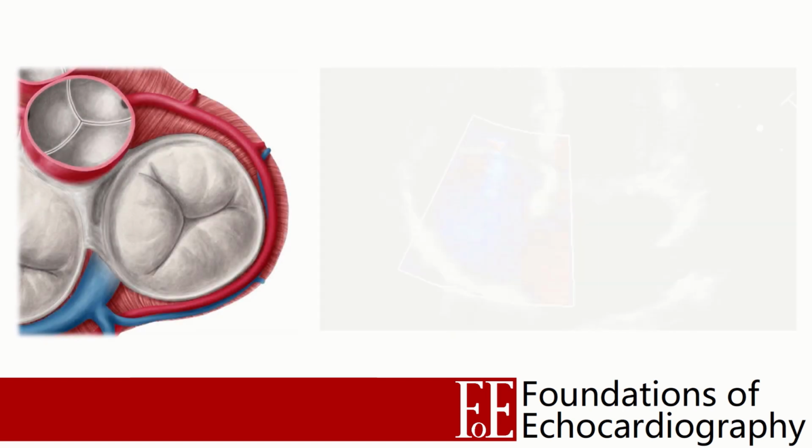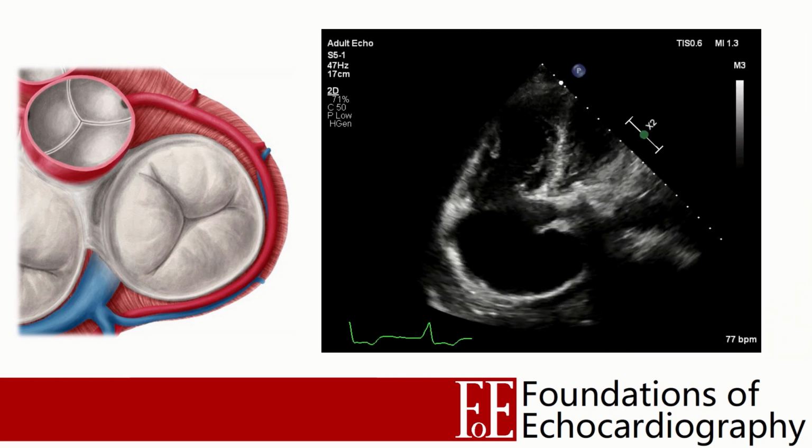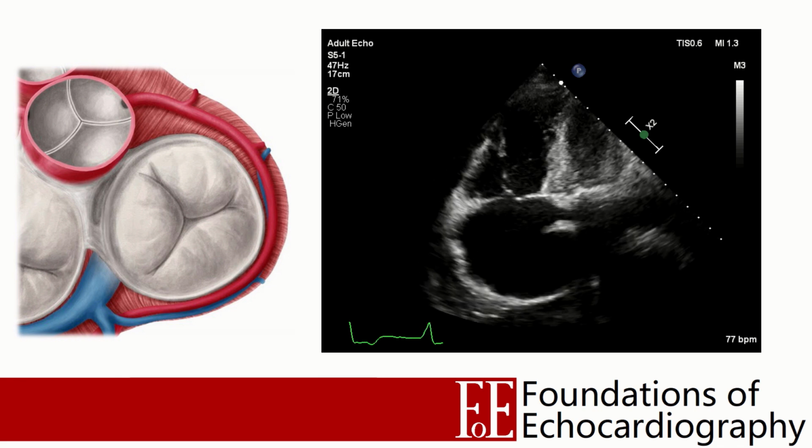Another important consideration is that the tricuspid valve has multiple coaptation lines, and therefore depending on the etiology of the regurgitation, it's very possible to have multiple eccentric jets coexisting, and how the jet appears on echo will vary depending on how it's bisected. This 2D clip is taken from an elderly patient with a history of previous tissue aortic valve replacement and COPD leading to pulmonary hypertension and RV dilatation.